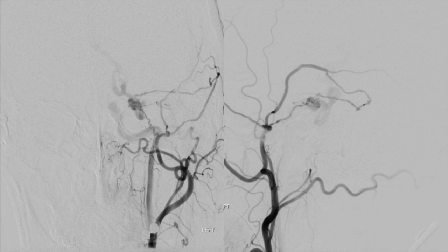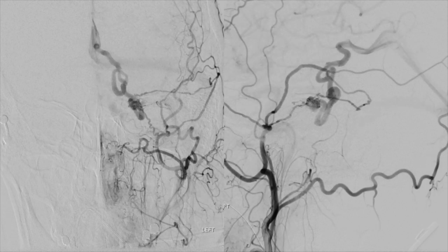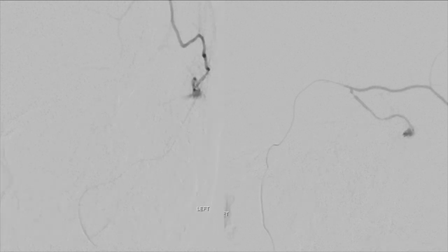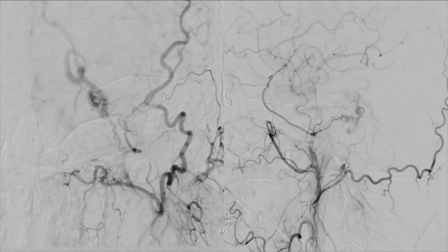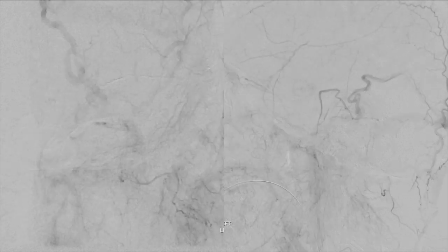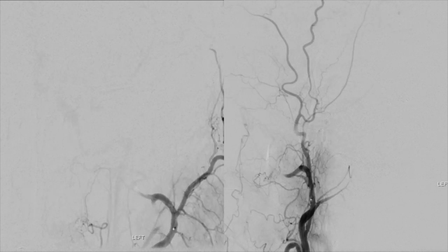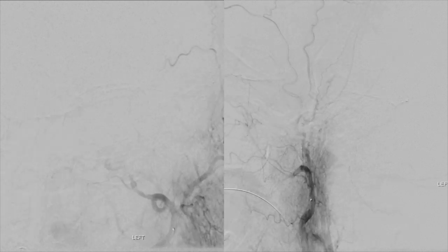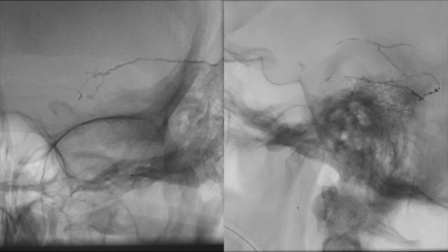However, the actual feeders were very narrow and challenged the ability of a marathon microcatheter to achieve close proximity to the nidus. Despite access of two branches, we were not able to achieve sufficient nidus penetration. Even though final control external carotid injections failed to show early venous opacification, follow-up internal carotid injections showed, as expected, continuous nidus penetration.